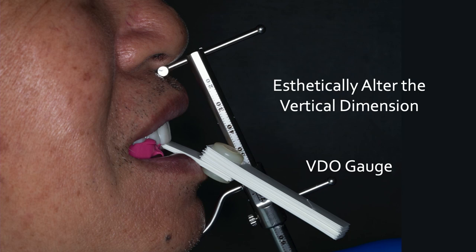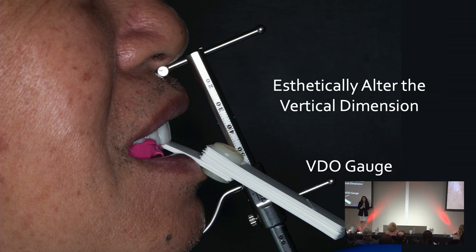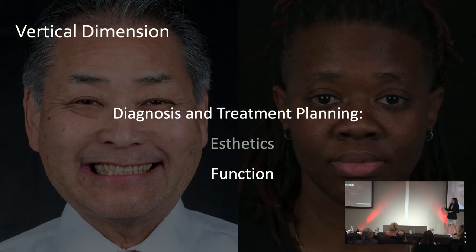The gauge I love to use is very simple — I use this for all of my full mouth rehabs, removable through fixed. This portion locks in so you measure the upper third: eyes to lips, you lock that in, and then it helps you gauge the lower area. Not everyone's face is perfectly symmetrical, so I use this to gauge the situation — it doesn't mean I always follow it. I use this in combination with a leaf gauge. I'm doing full mouth, I want to get them into a nice repeatable bite. The leaf gauge allows me to open them a little bit, take an open bite registration, and get the vertical I need in the relationship of the jaws. If I need to deprogram them and put them into a CR position, they can easily flow back into that position.